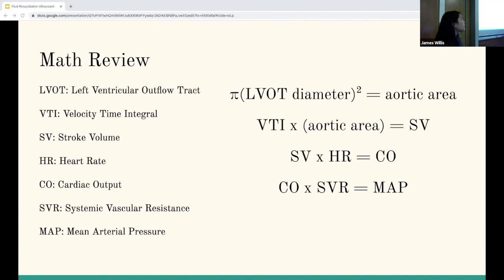I wanted to talk about it with fluid resuscitation because that's probably the most immediately applicable that I could think of for residents in the ED, but there's definitely a lot more applications, and there are a lot of papers proposing you combine this with your RUSH protocol to do more diagnostic thinking about this, the cognitive approach to shock.